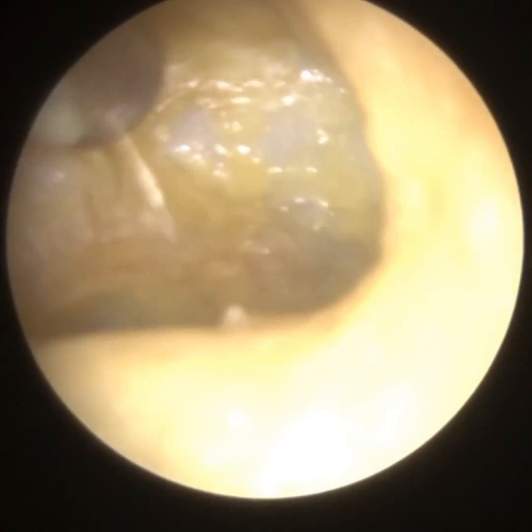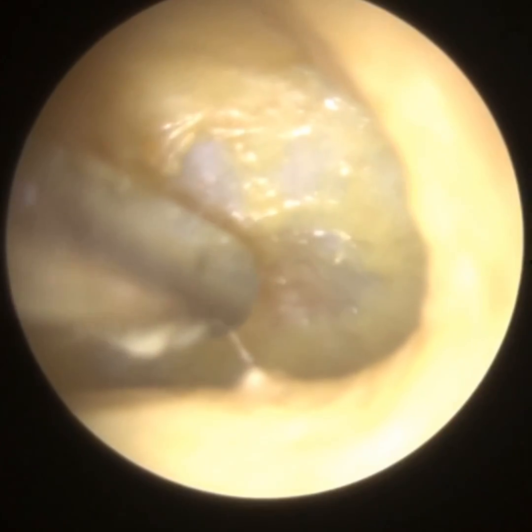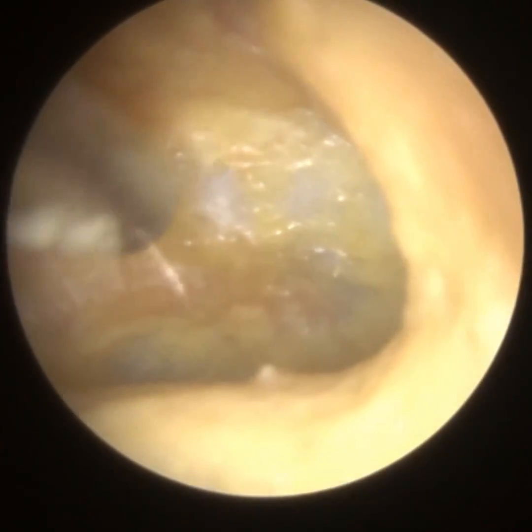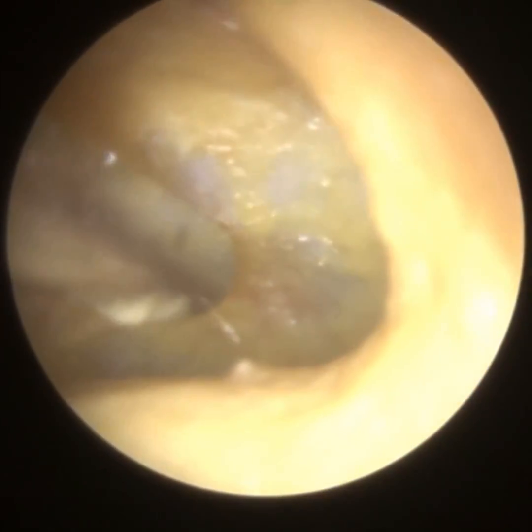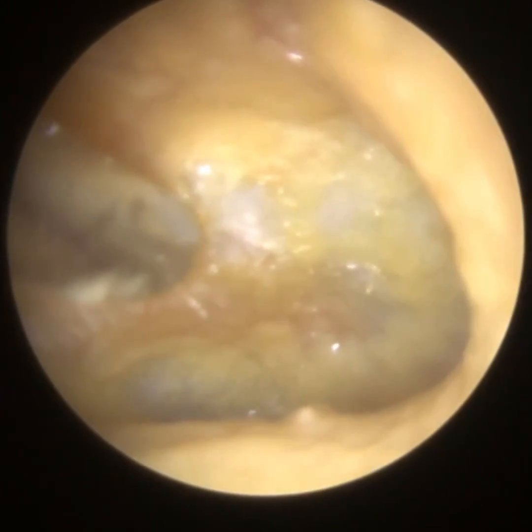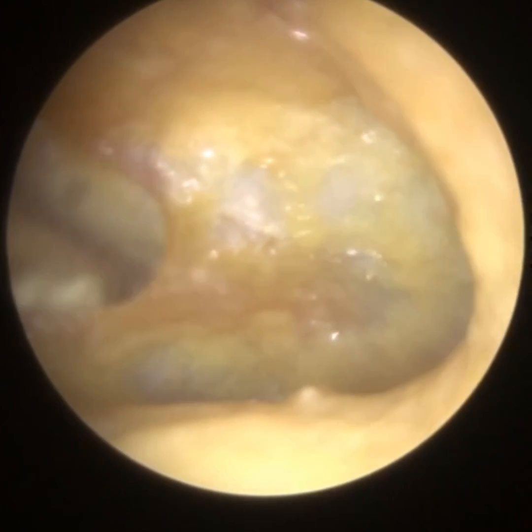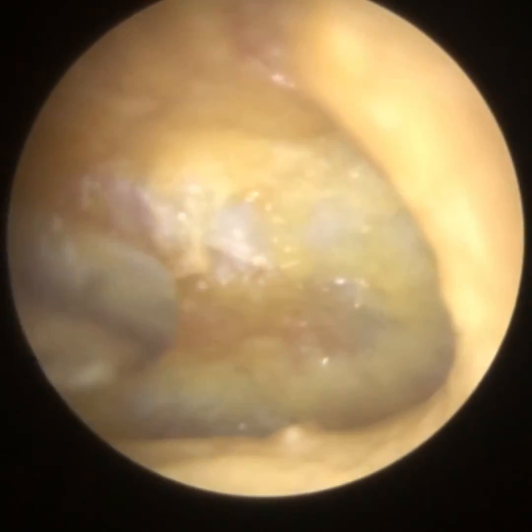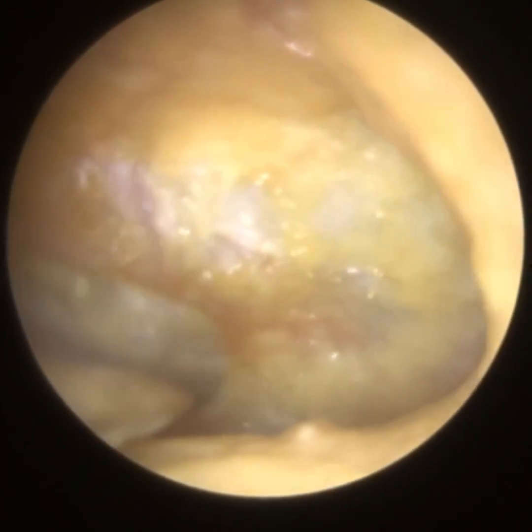A mastoid cavity is when the mastoid bone behind your ear gets infected and it's surgically drilled out, and that causes an enlargement of the ear canal. And so when you look in an ear with a mastoid cavity, if you're on my YouTube channel, you can do a search on mastoid, you'll see what I mean. The ear canal can be 3 or 4 times larger than what it should be, and that's because the infected bone's been drilled out, to prevent spread of this infection towards the skull.